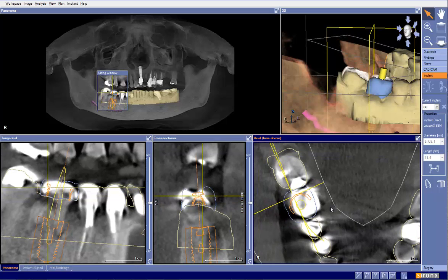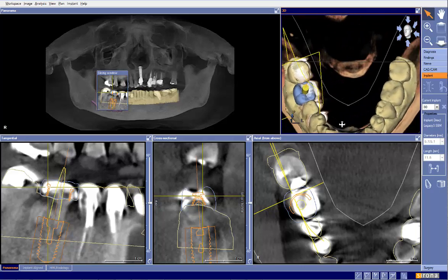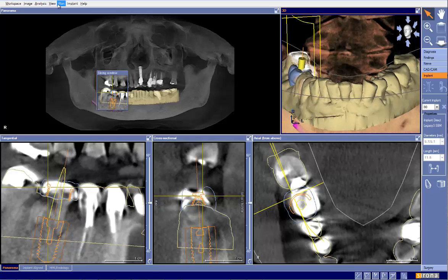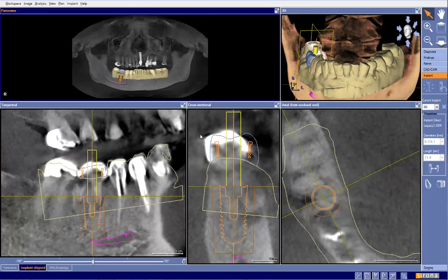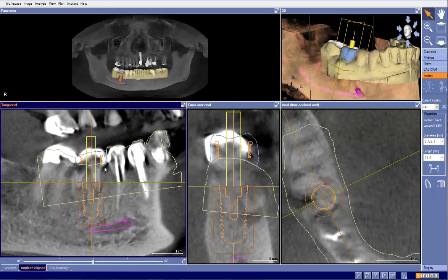The only thing I can see is the tooth seems to be a little bit more lingual to the proposed tooth, but that could be a lingually verted tooth that needs to be brought out to the buccal. So let's take a look at the original plan, making the assumption that this was done with guided surgery. My question is on this tissue here — this just doesn't seem to be the correct tissue for an immediate case. So there are several different questions we have to look at here.